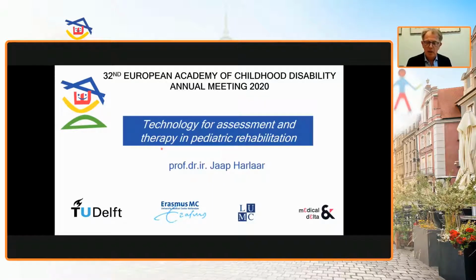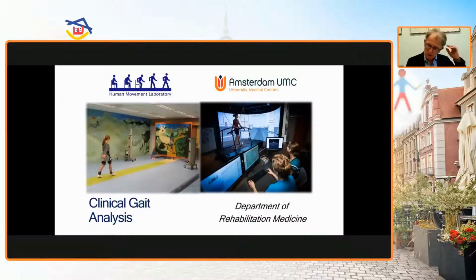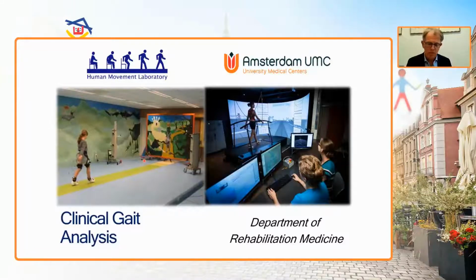But most of the things that I started were in the Department of Rehabilitation Medicine, what's now called Amsterdam UMC, to develop clinical gait analysis. And clinical gait analysis, especially applied for children with cerebral palsy, has been developed over the last decades quite a lot, thanks to technology, but also thanks to the intensive collaboration between engineers and clinicians who need to profit from that work. And doing so, I established a laboratory for clinical gait analysis, as well as an instrumented treadmill-based clinical gait analysis, together with virtual reality.